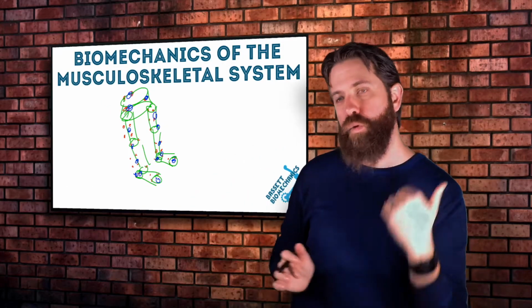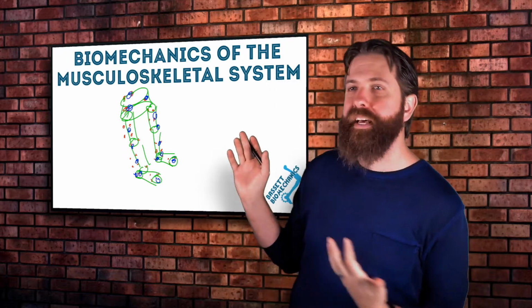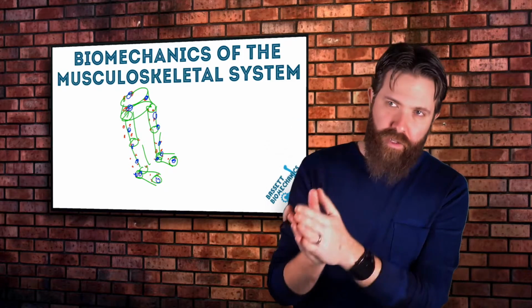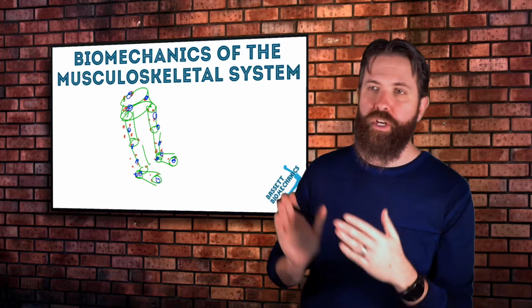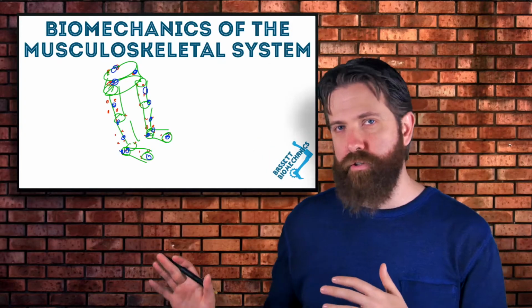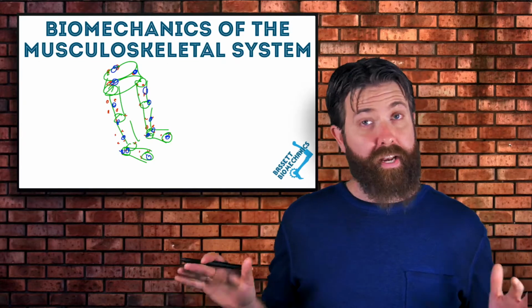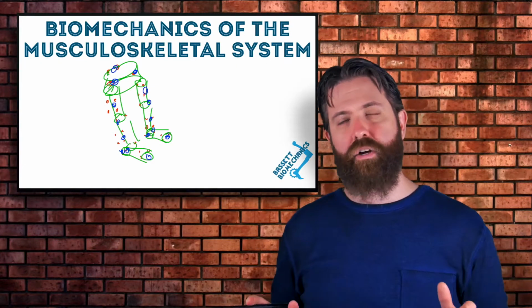We want to compare. We're going to use the data we collected right here in our studio with Jason, and we're going to compare the cluster type of approach to a conventional gait model approach, where we're going to use the same markers. It's going to be the same exact trial, so recorded, everything the same, and frankly not optimal. You'll see that the data recorded here was not great.